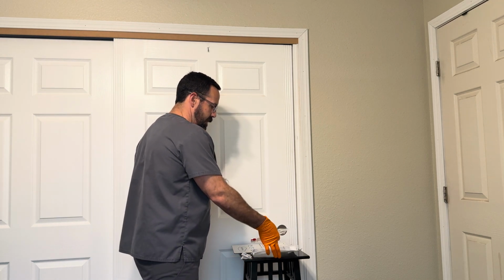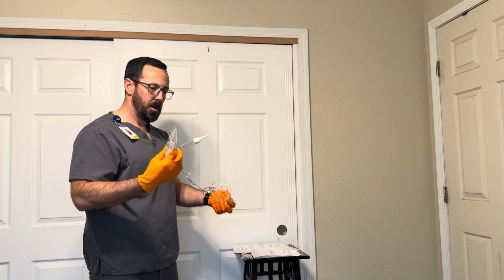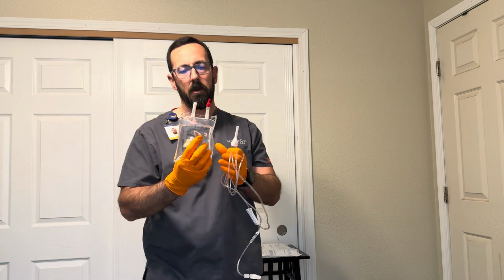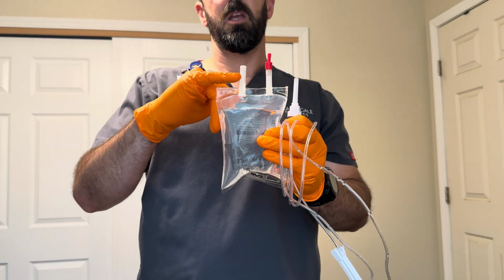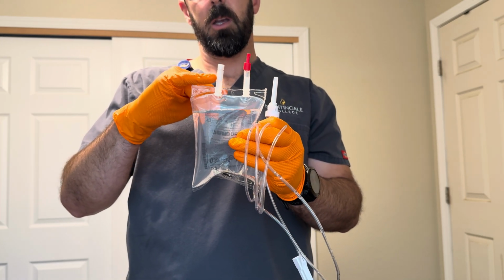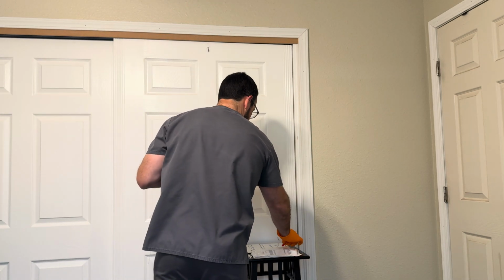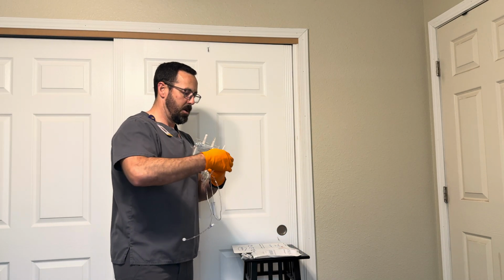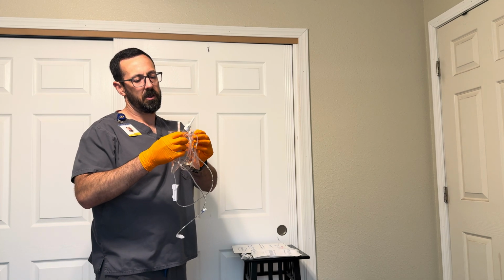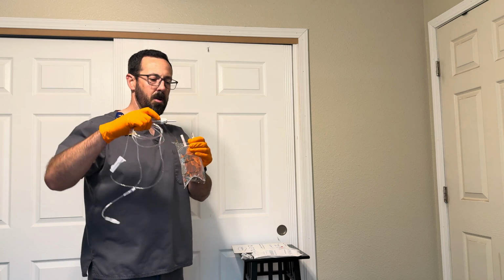So we're going to go ahead and use the spike to spike the bag. Going over the IV bag, I have a medication administration port if I ever need to add to the IV bag, and then I have my spike port. So I'll remove my little rubber top, and again, ensure that the spike stays sterile.